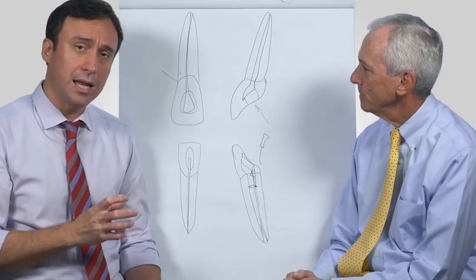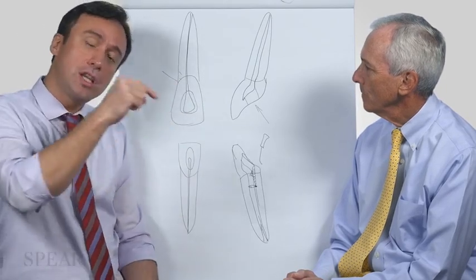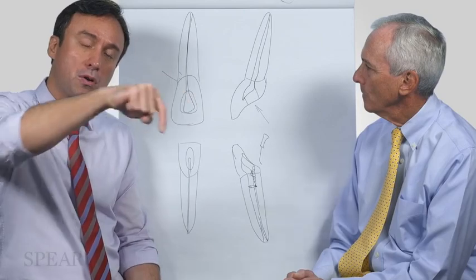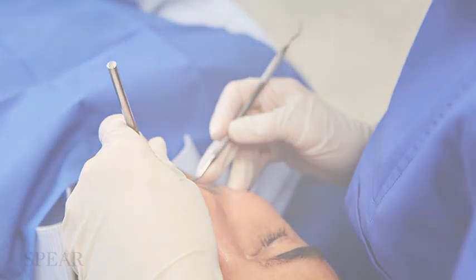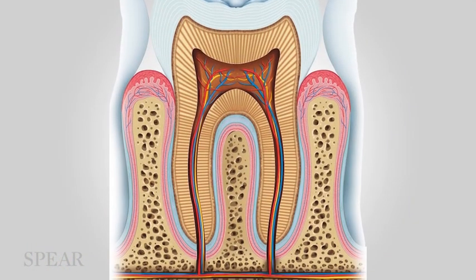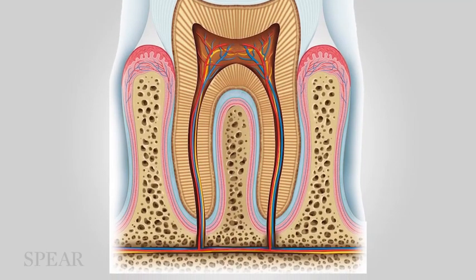And because of the inclination, you don't know that unless you tactilely get your DG16 and explore around, the way you would be probing around the tooth. With a perio probe, you would use a DG16 Explorer and touch the root. You're sounding the root, the way you sound the bone, and you're creating a map of it, so that you can get better direction.